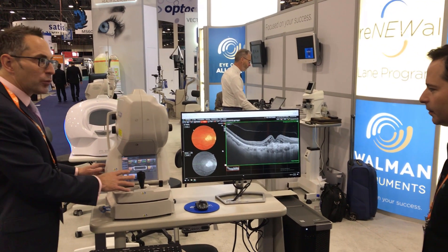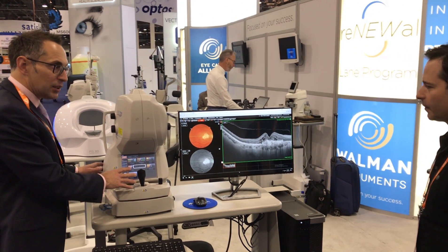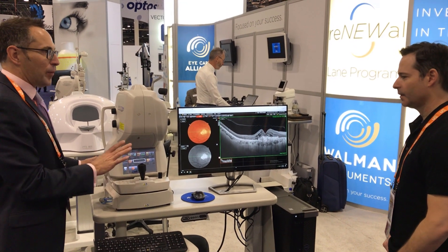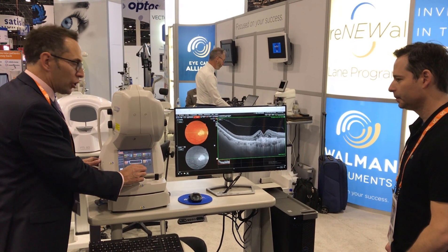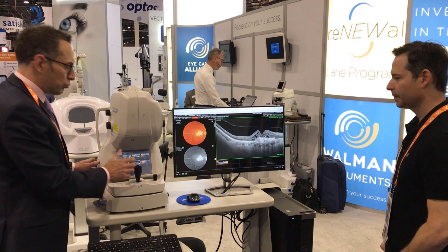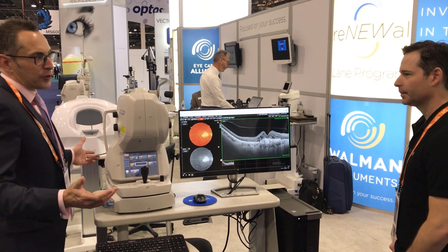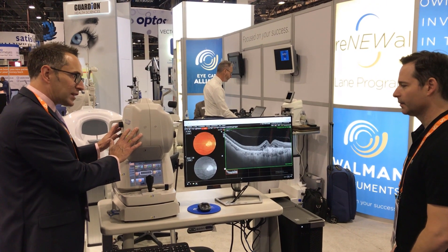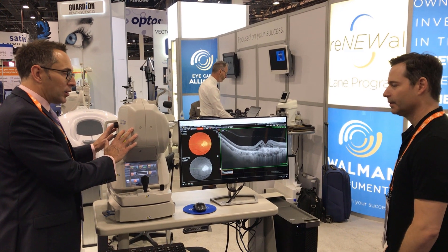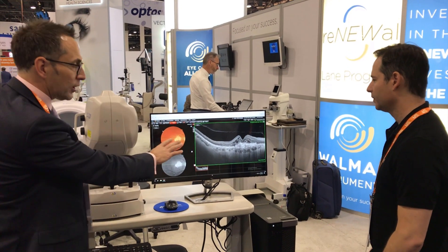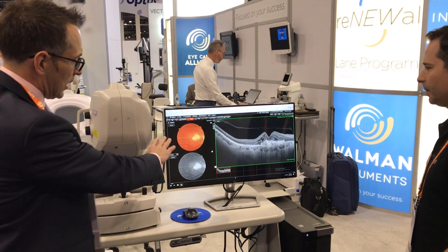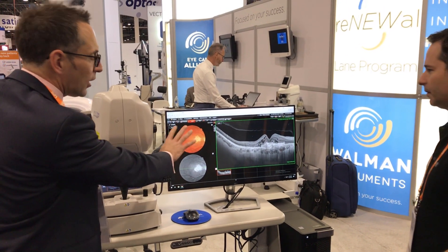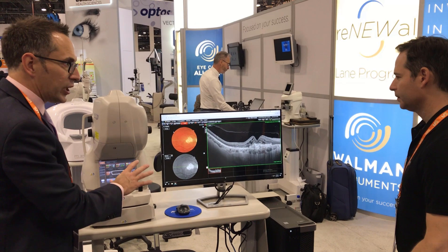What you have here is a joystick-driven device — on purpose — because with sick eyes, automation is great, but we want to be able to manage our patient. It's really simple to operate, like a standard fundus camera, with 100,000 A-scans per second that's going to capture phenomenal images. In this case, a high resolution single line looking at this pathology.